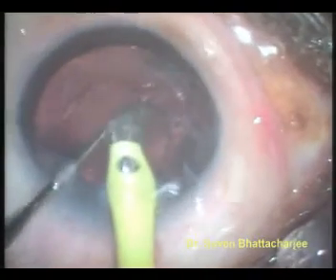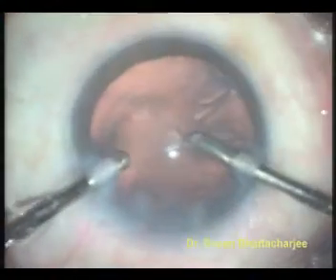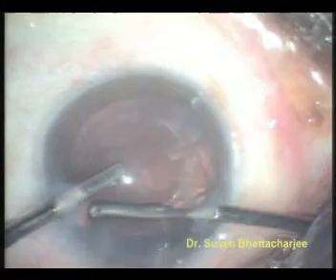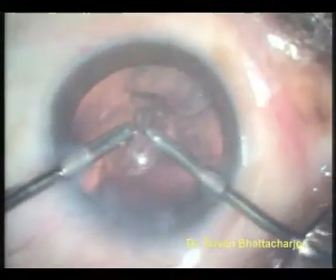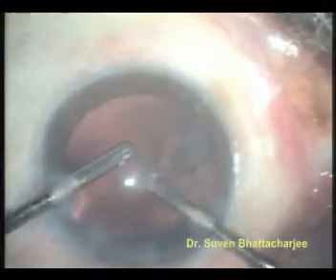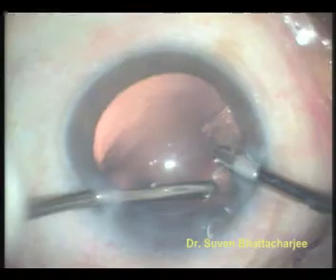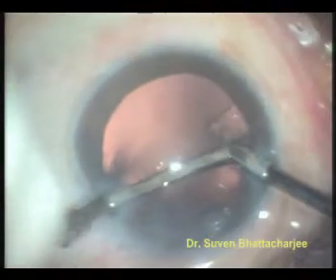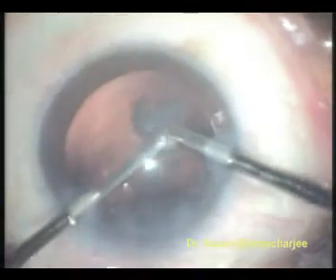Now we are left with a circular opening in the transparent capsular bag with the fleshy cortex. This fleshy cortex is removed by simultaneous bimanual irrigation and aspiration. The aspiration probe reaches under the capsule and brings out the fleshy cortex while the infusion keeps the anterior chamber formed. The aspiration probe is moved from the right to the left hand to allow access to all parts of the capsular bag.